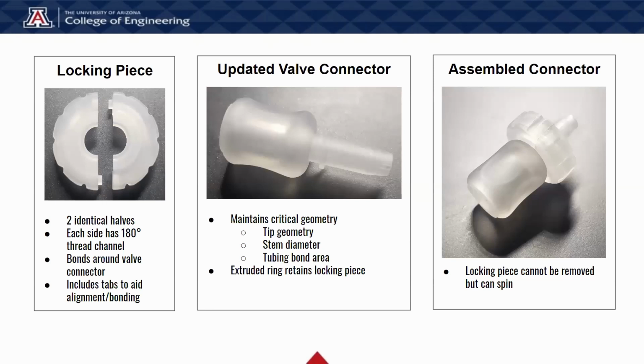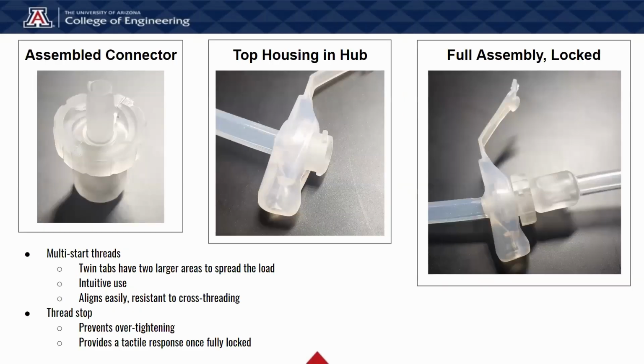We've also maintained a significant amount of the geometry of the actual valve connector, as the previous tip worked very well with the Ziridium silicone valve. You can see here how the multi-start thread connects to the top housing. The top housing has two tabs which meet into the two threads in the locking piece. This multi-start design allows for intuitive screw-on use, but also makes alignment easier and reduces the risk of cross-threading.